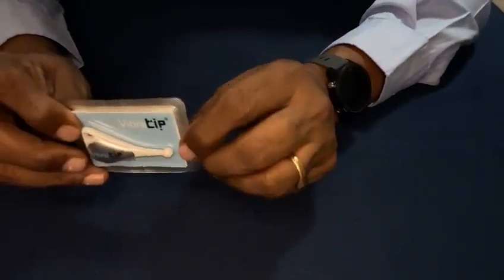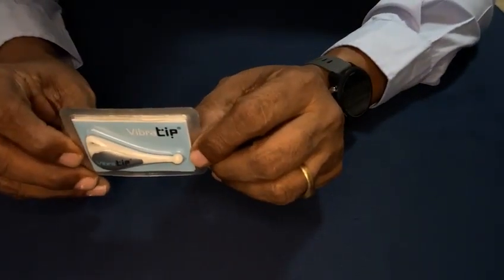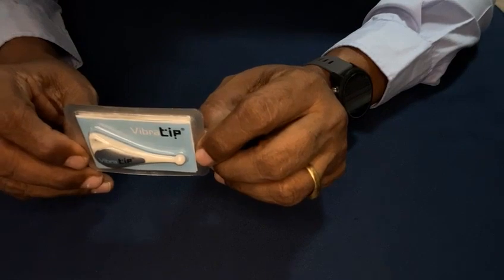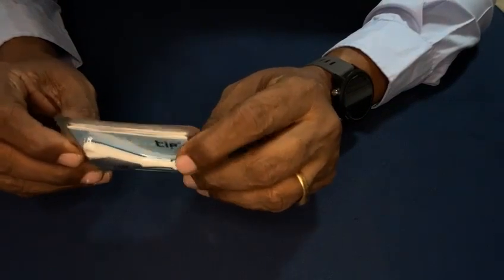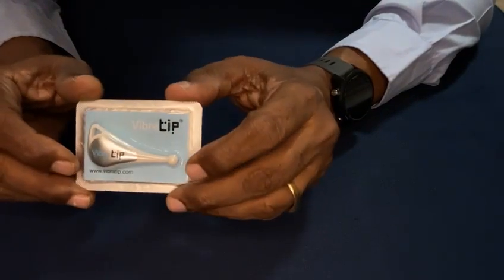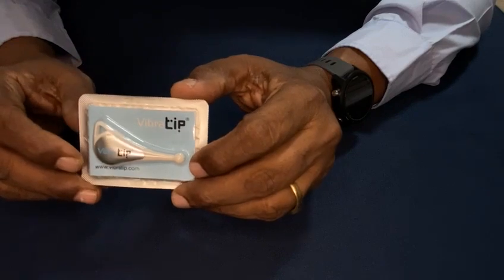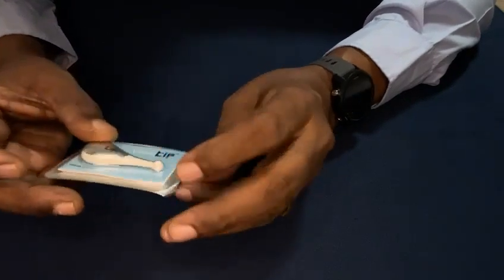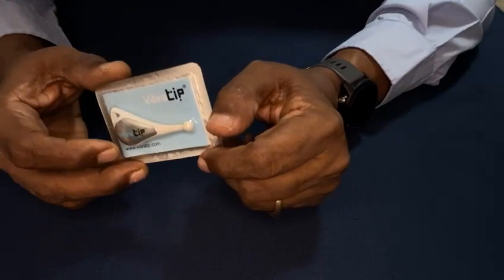This is our VibraTip electronic tuning fork. It vibrates at 125 hertz and the vibration strength is equivalent to 25 volts.